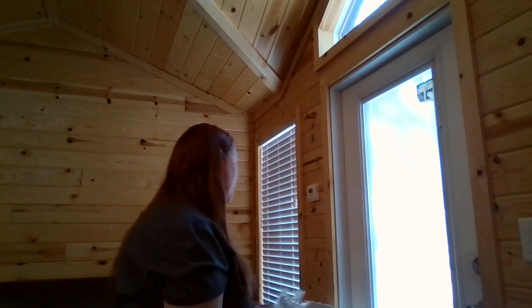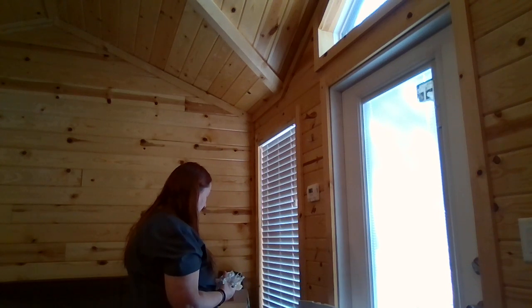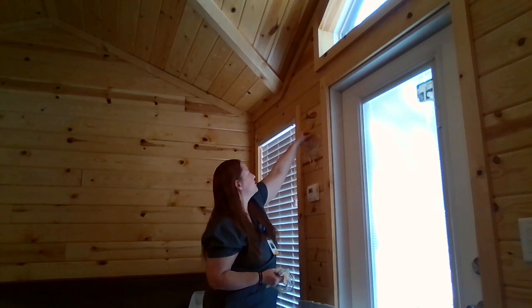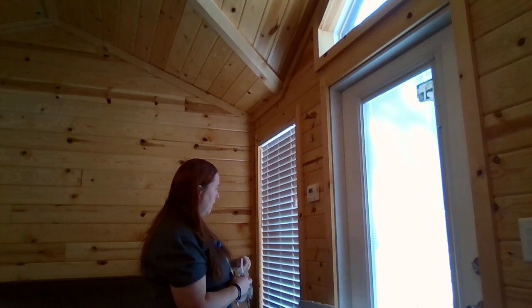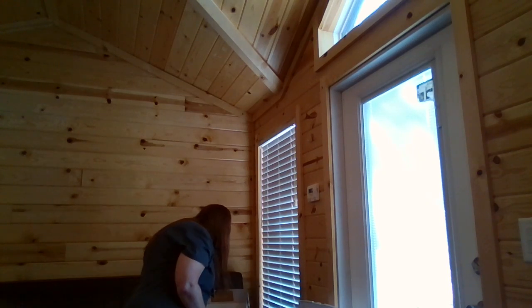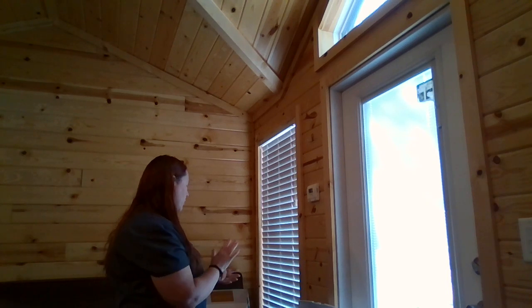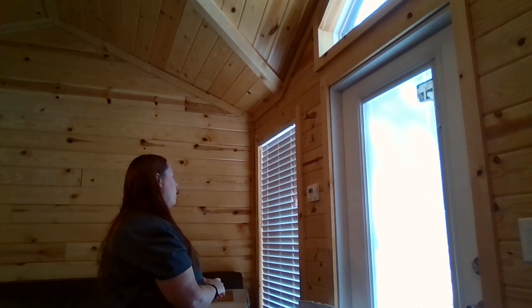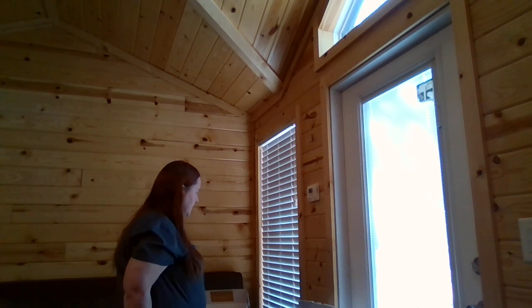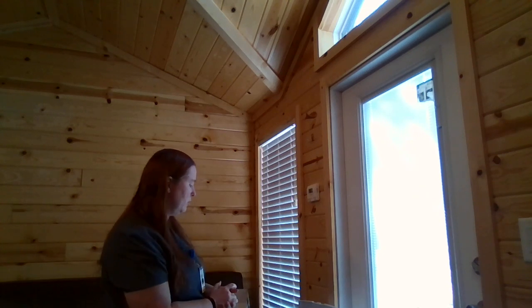Okay, so hello, my name is Wendy. I'm going to be your nurse today. Can you tell me your name? Oh, Mrs. Jones, good to meet you. Can you tell me your date of birth? Okay, thank you. Today I'm going to be hanging IV fluid medications to hang your antibiotics. So I'm just going to get all my stuff ready. Do you have any allergies to amoxicillin? Okay, thank you. You don't.